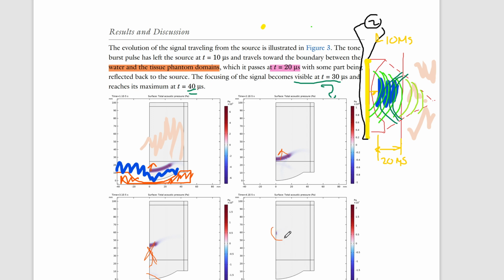Okay, but at time is equal to 40 microseconds. Look at this, 40 microseconds. We have this. And that must be what they mean by our signal reaching its maximum. Now, we want to see darker reds. Highest pressure. I don't know if this describes that well because is this the darkest red? This is looking pretty dark to me. Not the bottom, this one. So that's a little confusing.